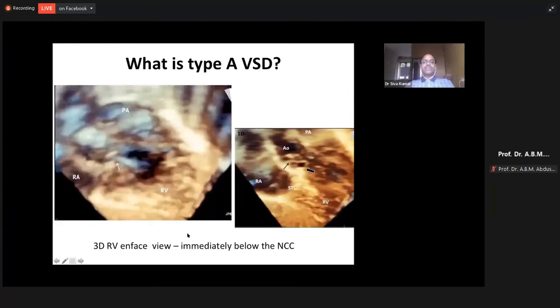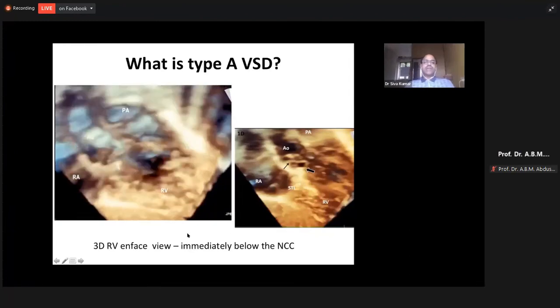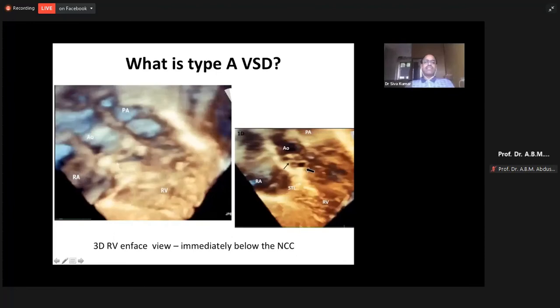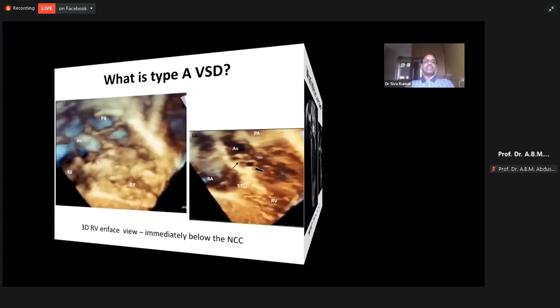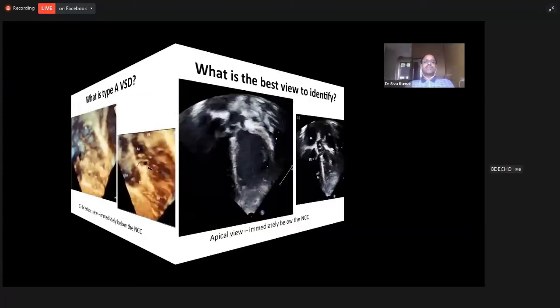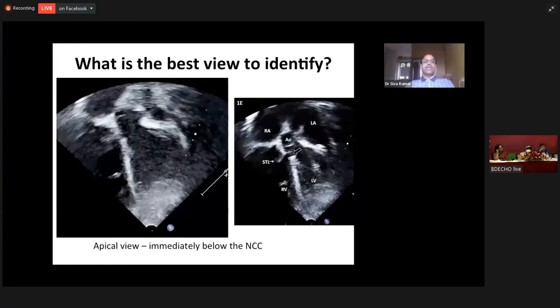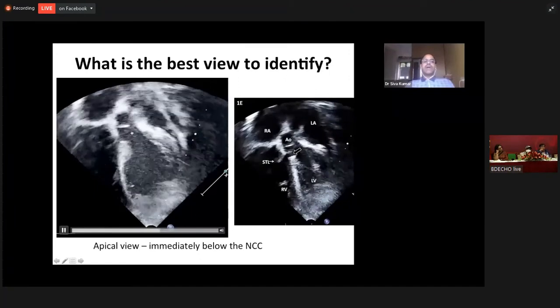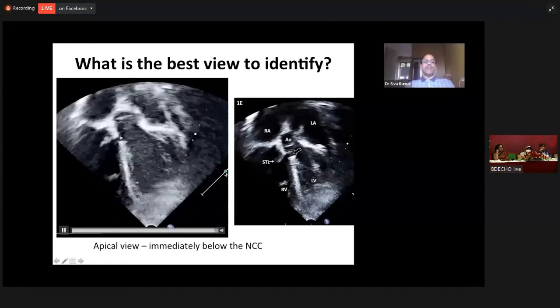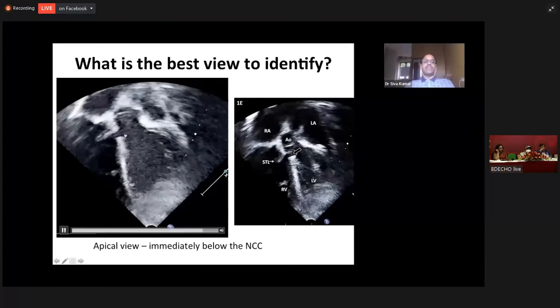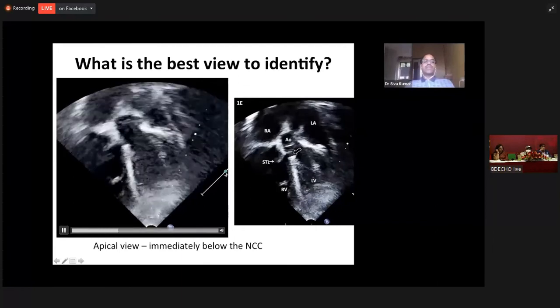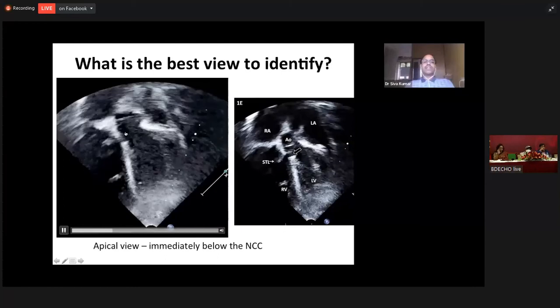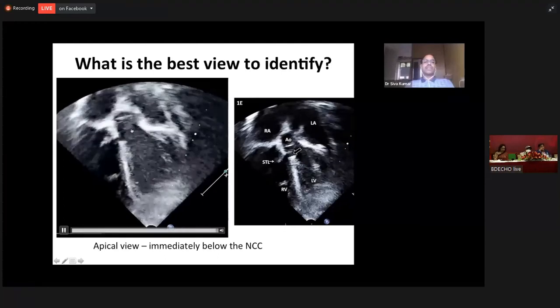With these VSDs, we have to carefully place the device because the aortic valve leaflets can be touching the devices. It is seen well on an apical five-chamber view, where the ventricular septal defect is very close to the aortic valve leaflets. Here you can see the aortic valve leaflets almost touching the superior edge of the VSD.